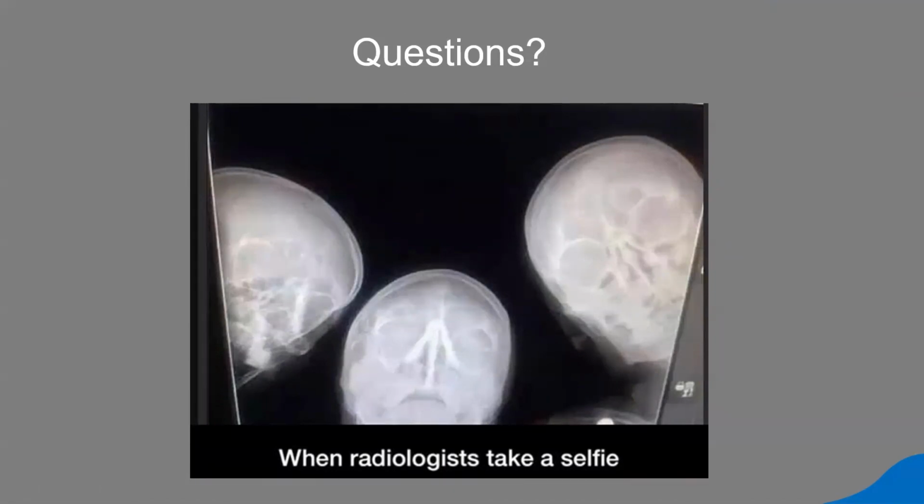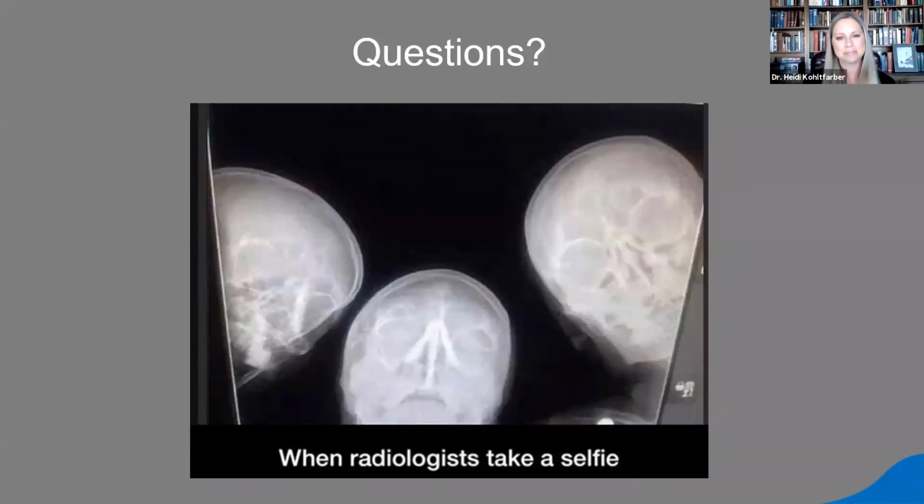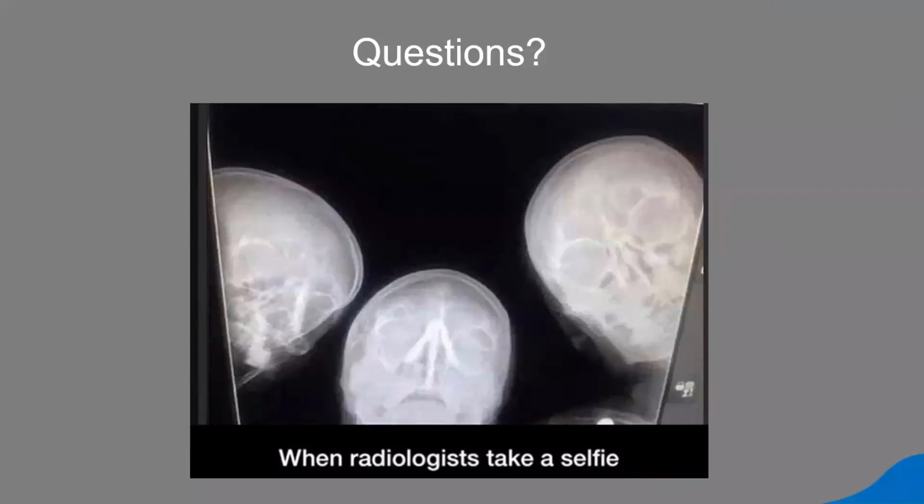So an MRI and CBCT show hard and soft tissue. Is that correct? That's right. Okay. Why is it so hard to find a good ENT? Ooh, that's a good question.